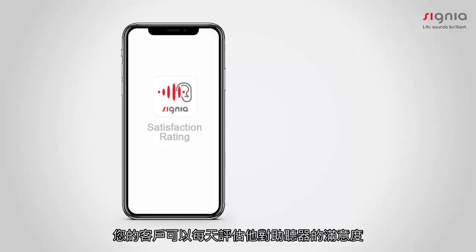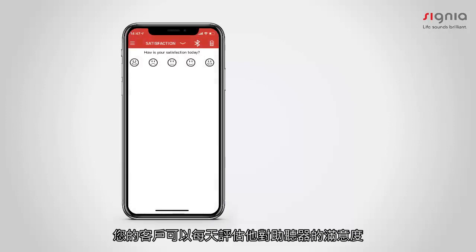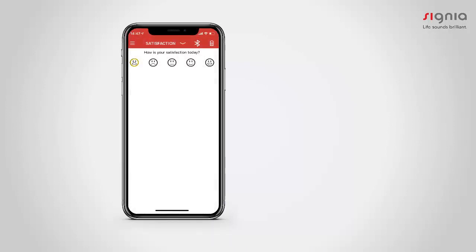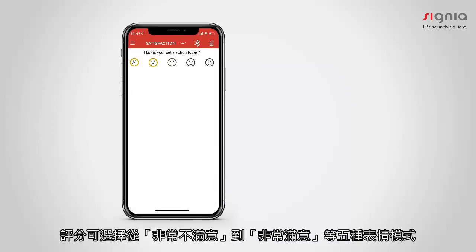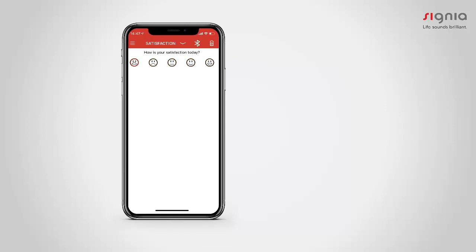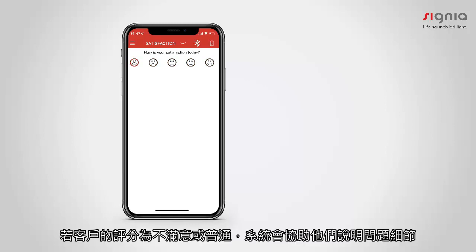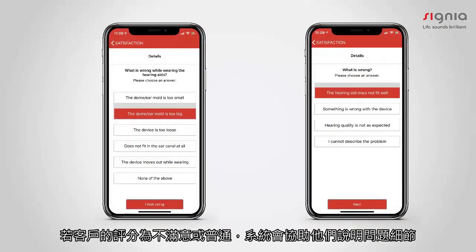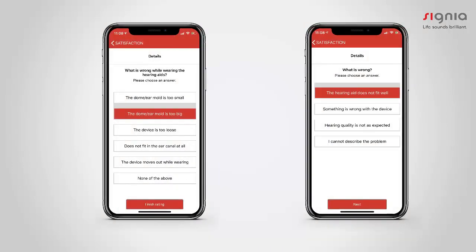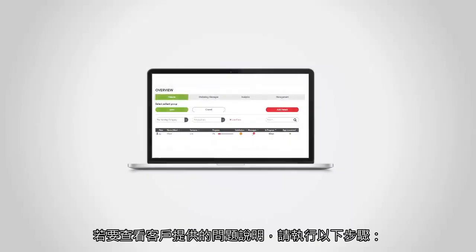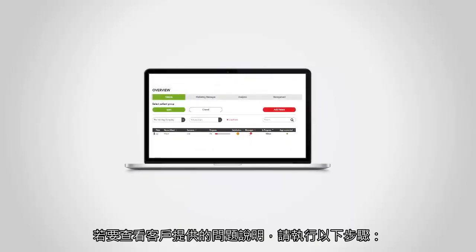Your clients have the possibility to rate their satisfaction daily. This rating is based on five smileys, from very dissatisfied to very satisfied. If your client sends an unsatisfactory or neutral rating, they will be asked to specify their problem.